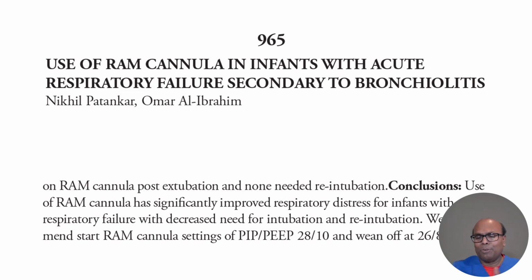The RAM cannula settings they recommend is 28/10, and wean off when you can go down to 26/8. Even though it is a narrow level, the point I want to make is that the higher level of PIP and PEEP doesn't actually translate into intra-alveolar pressures. Most of these pressures are lost in the nares and also in the mouth. So as a result, the pressure reached in the lower airway is much smaller than what you see here.